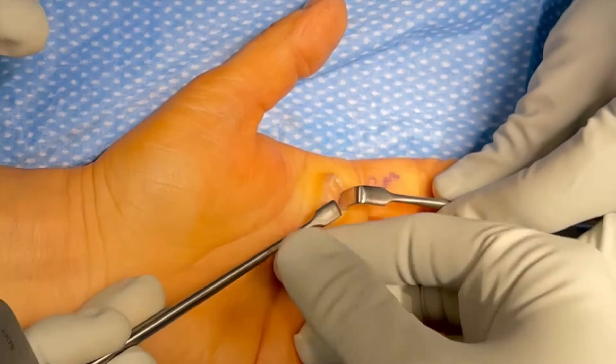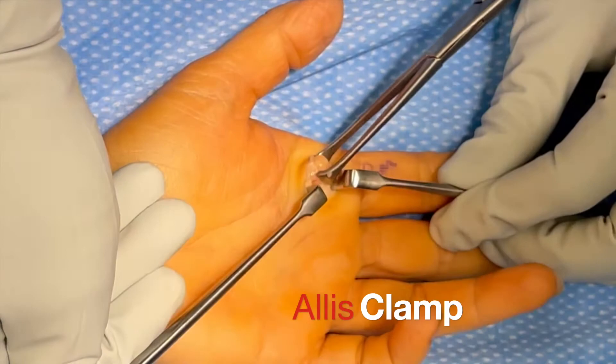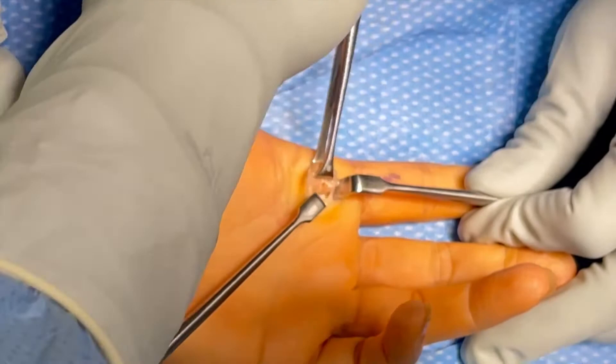At this point we're going to take a special clamp called an Allis clamp — A-L-L-I-S — to grasp onto the tumor itself so that we can manipulate and handle it. That way I can pull it in one direction to dissect underneath it and separate it from the underlying A1 pulley without damaging the tumor.